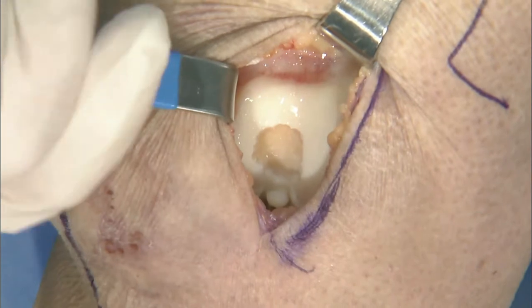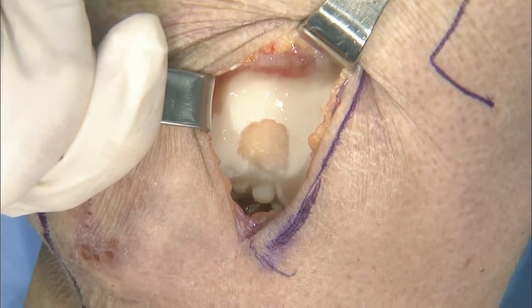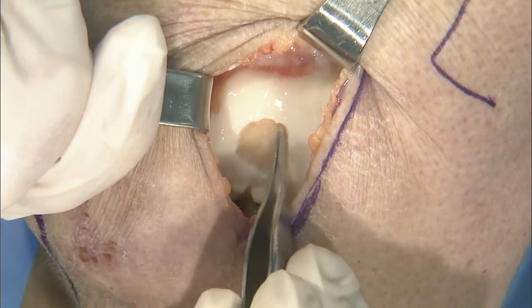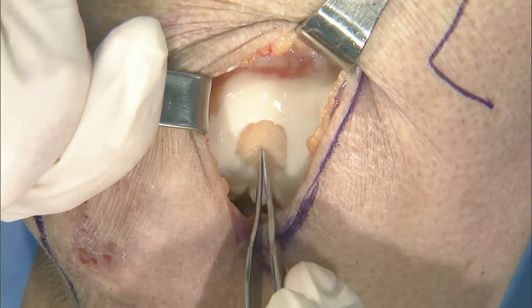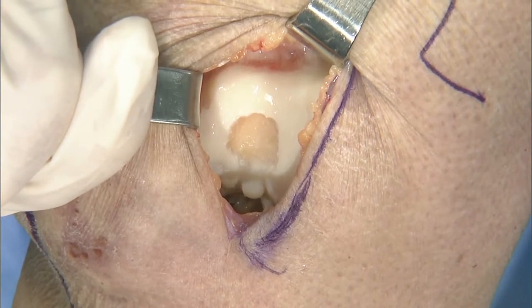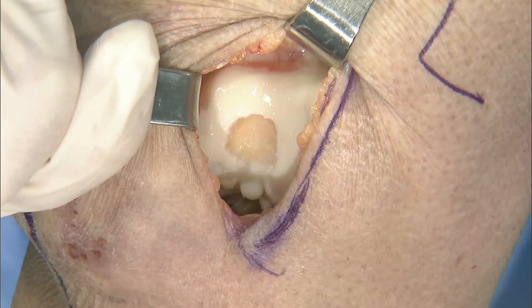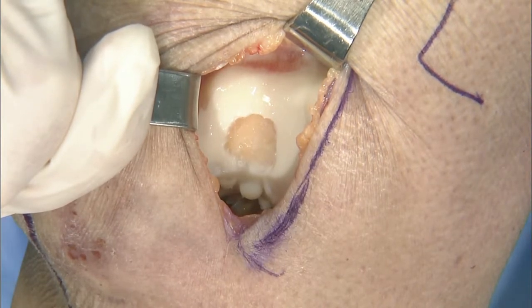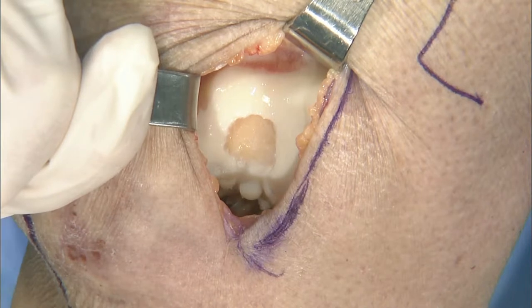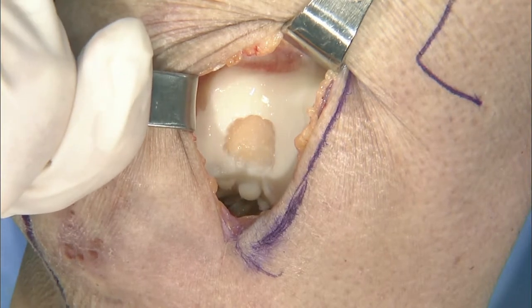Okay, so now that we have our membrane and our template or our implant set up, we want to talk about what you do in terms of the bleeding here, because you can't have bleeding. I actually do these with no tourniquet, and I only put the tourniquet up if I'm having problems, because I like to control the bleeding as I go, and I feel that it gives me a good idea of how deep my defect prep is. If I see a lot of bleeding, I know, okay, I'm deep enough, and that's also not something I want once I have that MACI implant in there.